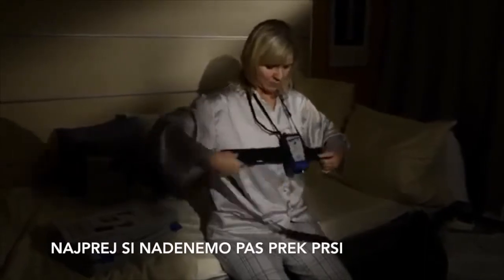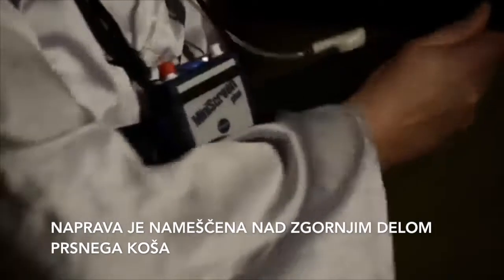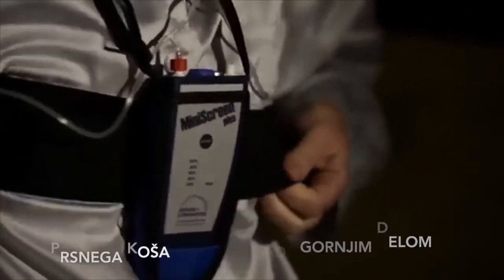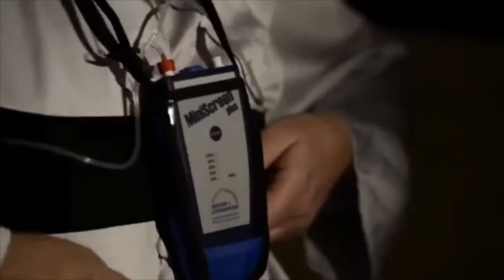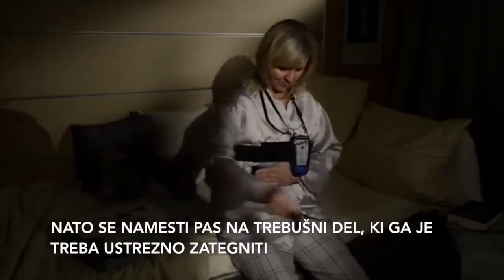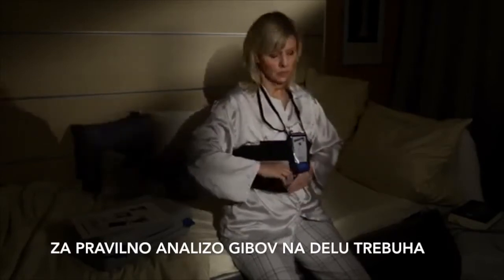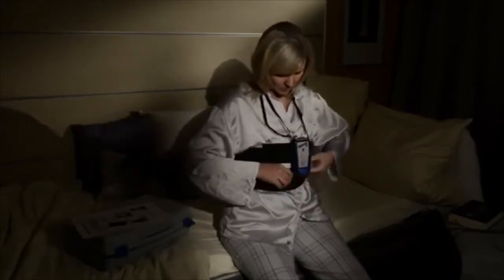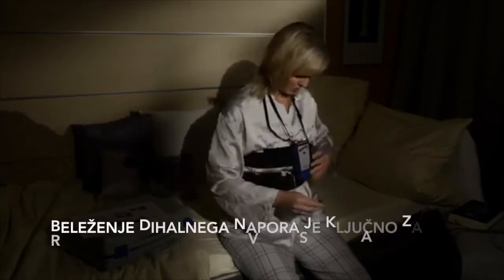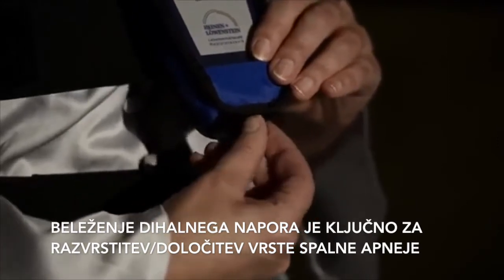First of all, the patient will pull on the chest belt with the device situated over the upper chest. And then he will pull on the abdomen belt, which should be tightened properly for analyzing the abdominal movements correctly. This registration of the respiratory efforts is needed for the classification of the sleep apneas.